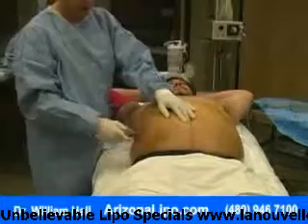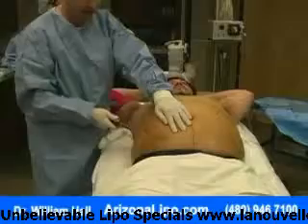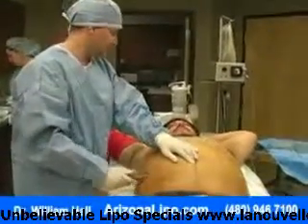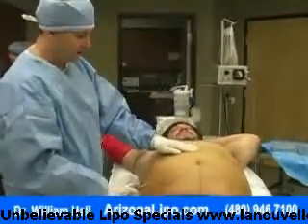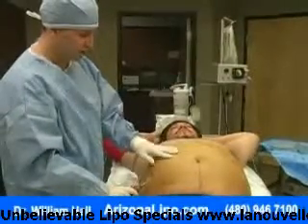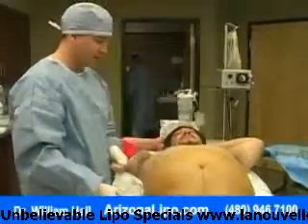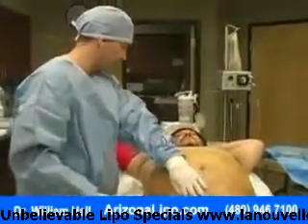Your fat is really soft. That's good because that dictates how long the suction is going to take to get the fat out. That is all different consistencies, and what one person your size could take you double the amount that another person takes. Is that right? There's just a lot of variation. A lot of people think that you just stick a tube in and the fat comes out pretty much the same, but a lot of variation from person to person. Right. And it's important how your fat comes out because that's the amount of time that we spend in suctioning and working on the tissue, which directly affects your postoperative inflammation and soreness afterwards.